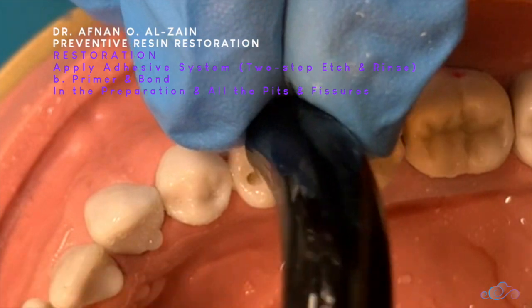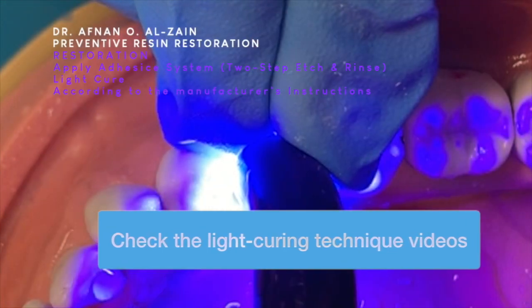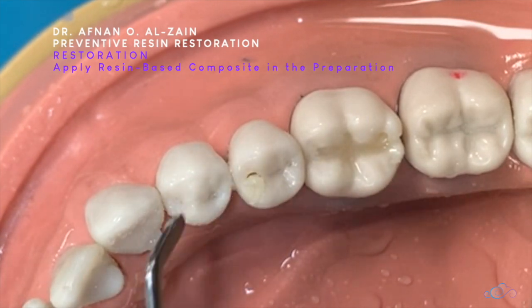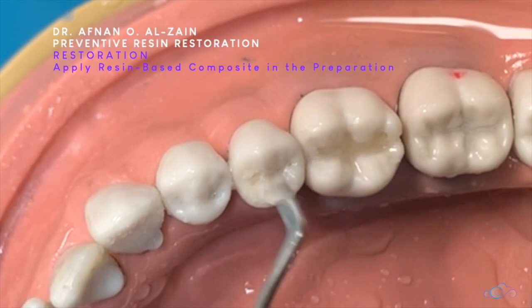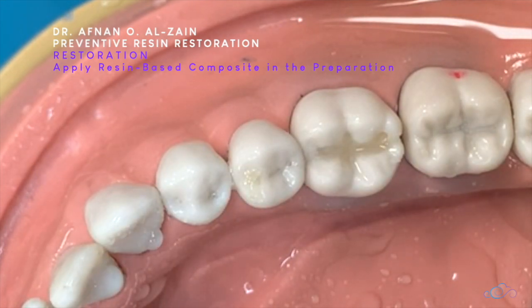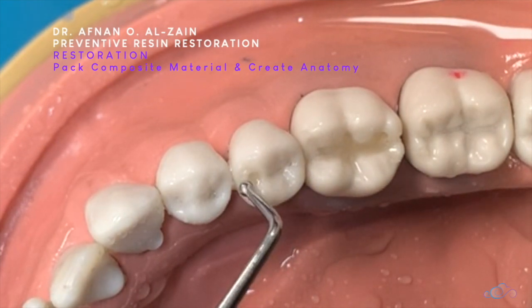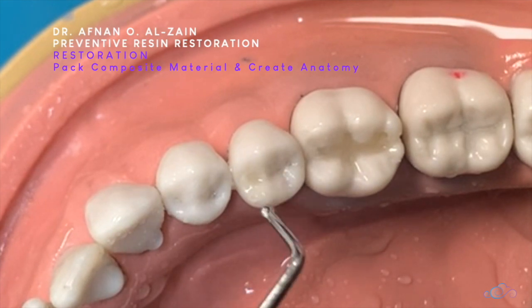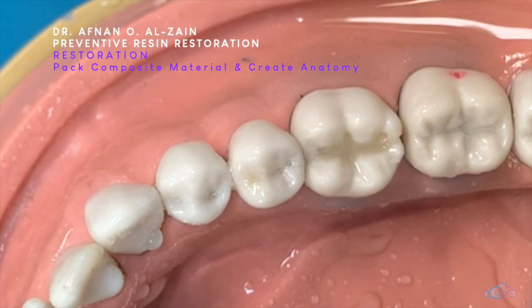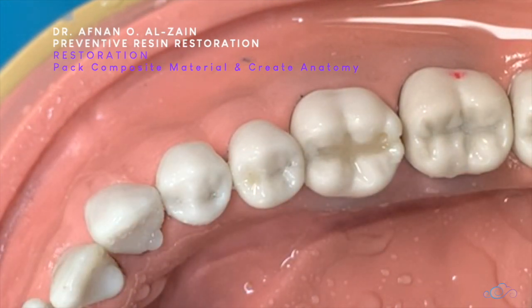We're going to light cure. Then we apply the composite in the pit in one increment — it is typically very small. We place it and insert it with the ball burnisher, then remove the excess. It is a very simple procedure — not creating too much anatomy, just creating the fissure. We light cure.